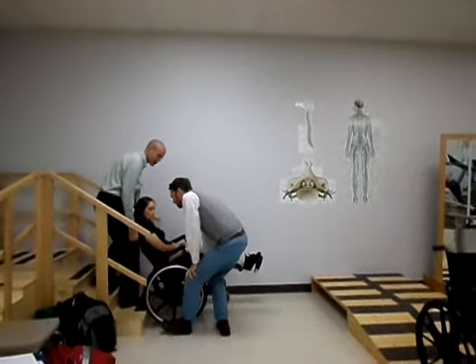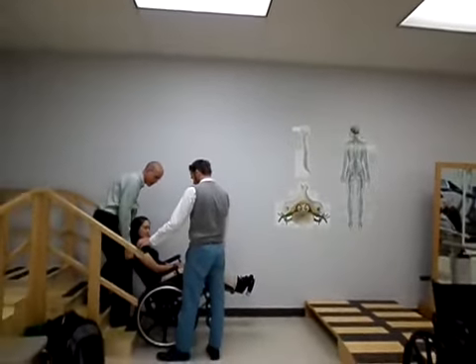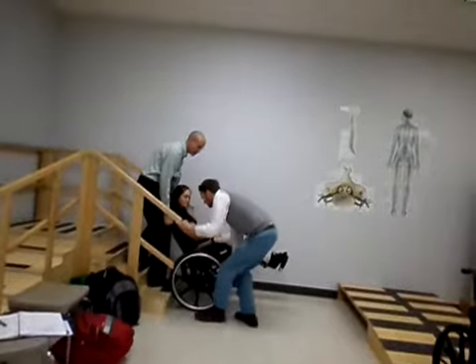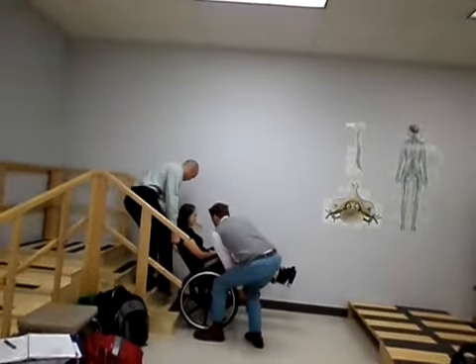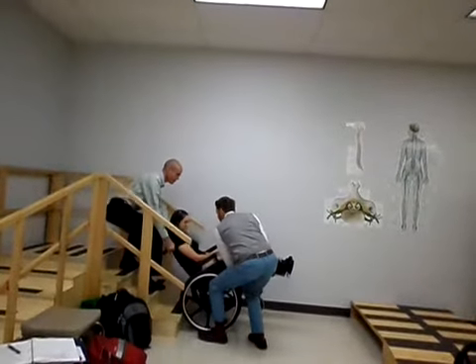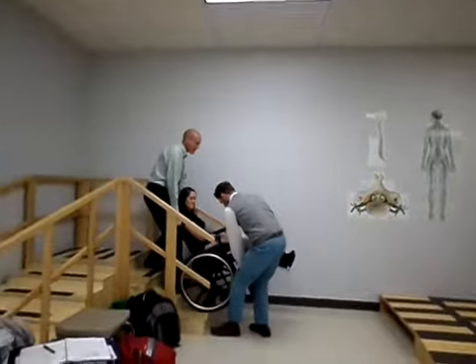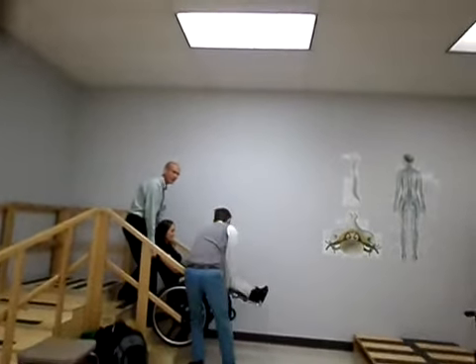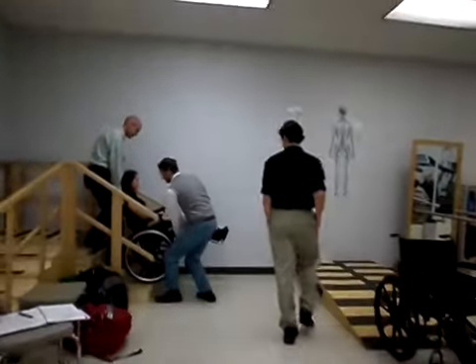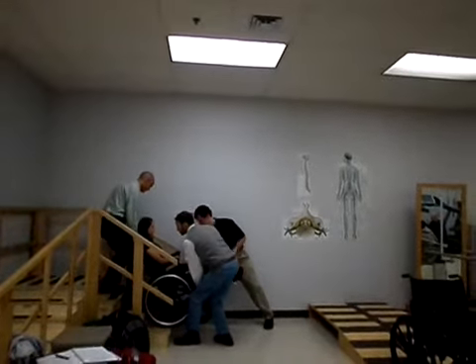Let's go ahead and let go up here and see if you can just hold on there. Yeah, you can have a hand right here. Where do you want me? Just on the side right there. All right, you have good biomechanics. On 3, we're going to go up 1 step. 1, 2, 3. Oh, I can do a little bit outward, huh? All right. Let's see, Seth, can you help over here? Try to get on the other side. See if you can get one hand. All right, up 1, 2, 3.